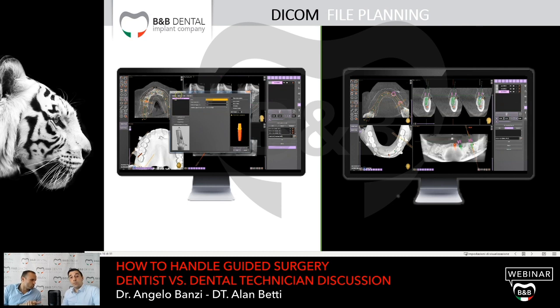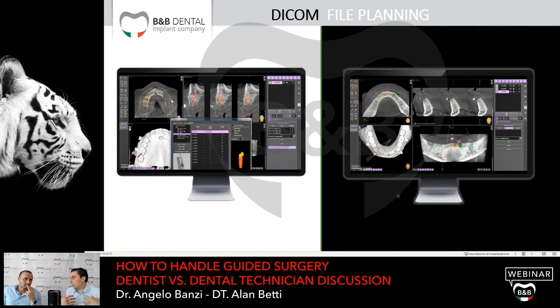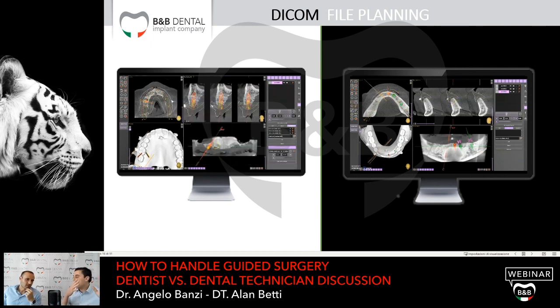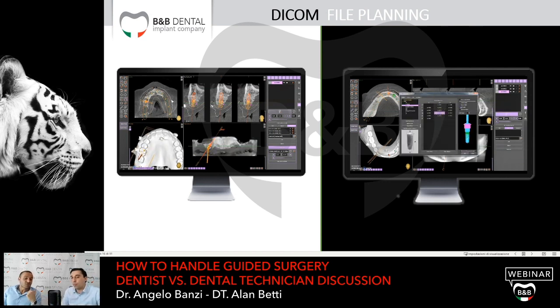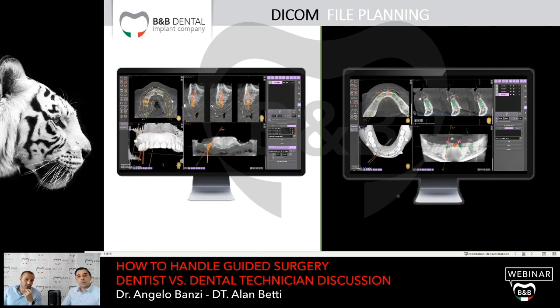Do you change? Yes, there is a button. There is a tool in our software where you can place all the implants you want, and then you can put them on the same axis. This is really important. During your planning, you can parallelize all the abutments one to one. This is really important, because this is what we want to have when we work with the guided technique.